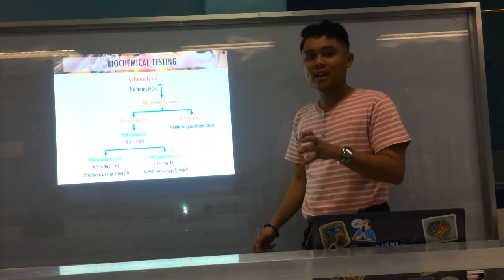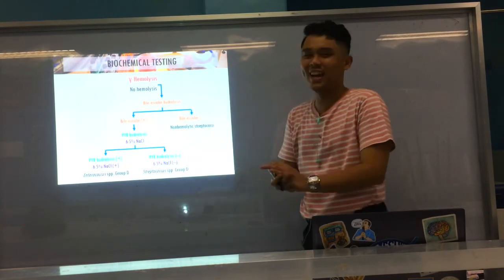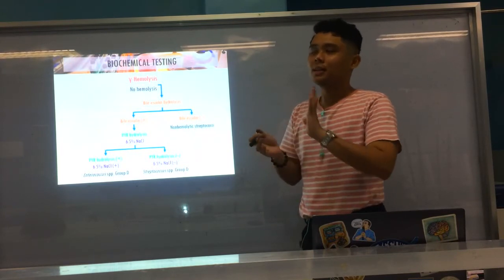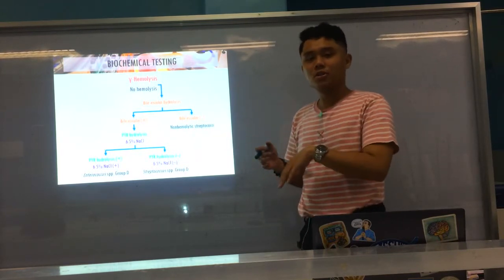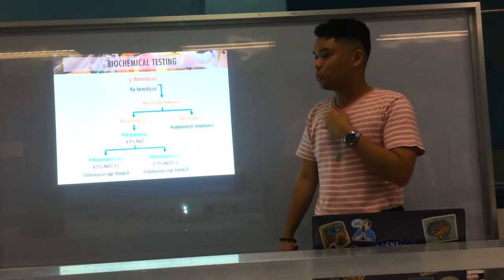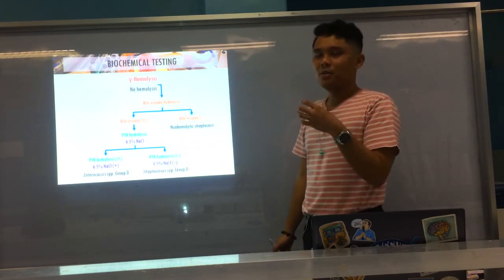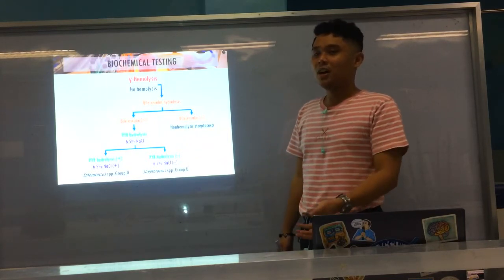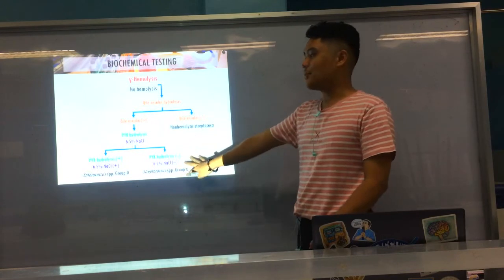So in a nutshell, gamma hemolysis is easy, right? Usually there are only a few strep, like Enterococcus and strep group D. If you really want to separate the Enterococcus species further, they have their own types of tests that are not elaborated here.